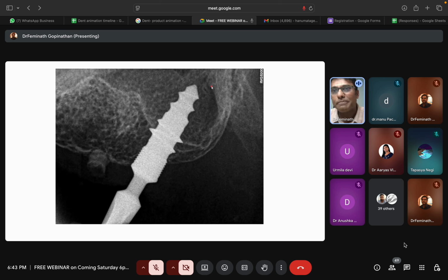This is the wing. This is the plate, pterygoid plate. You can see, this is the pterygoid plate. Now, if I travel 2 more rounds, I'll reach here. So that will be my target area.